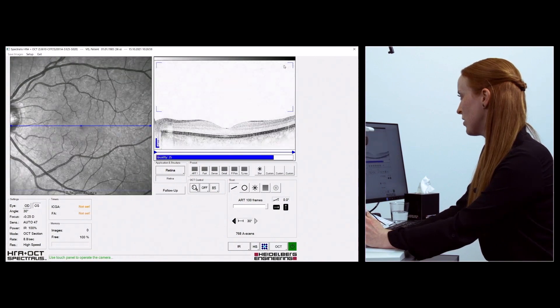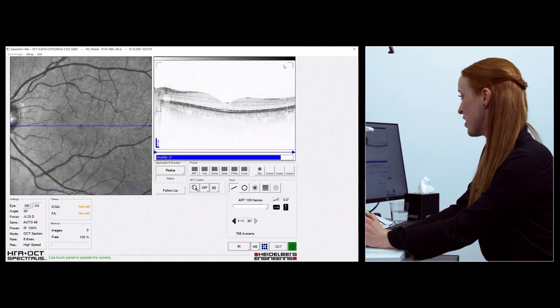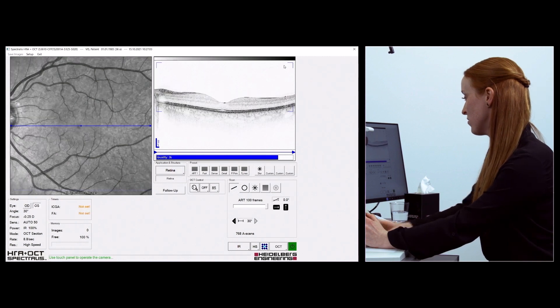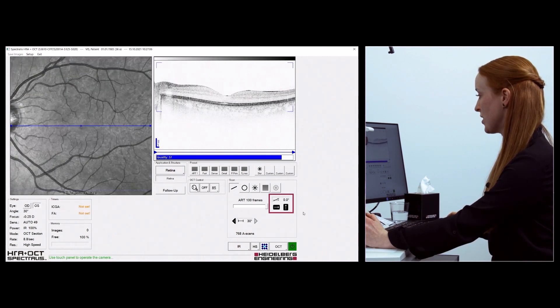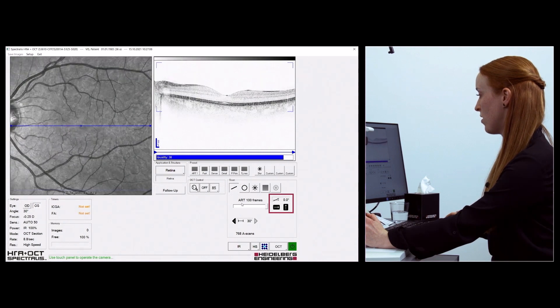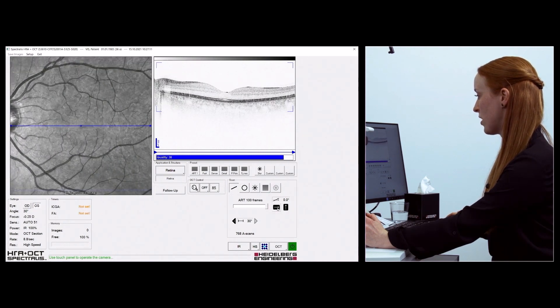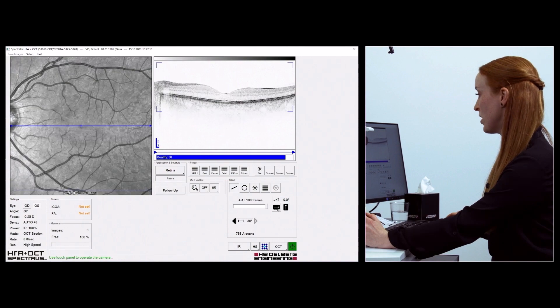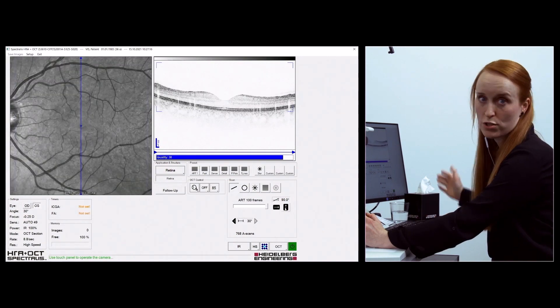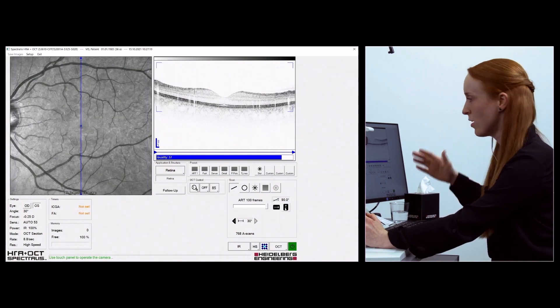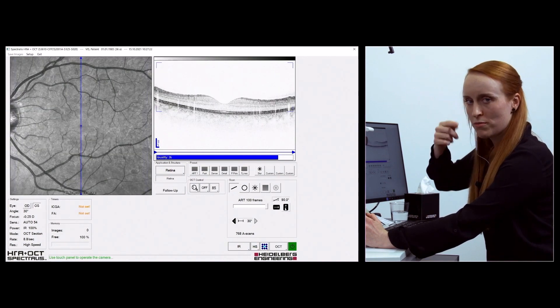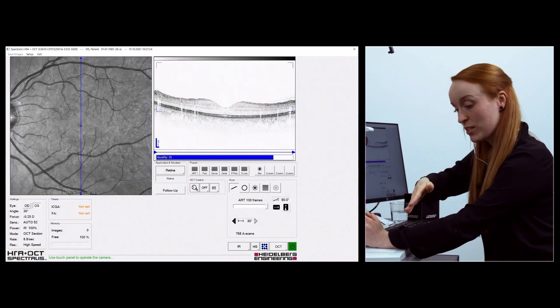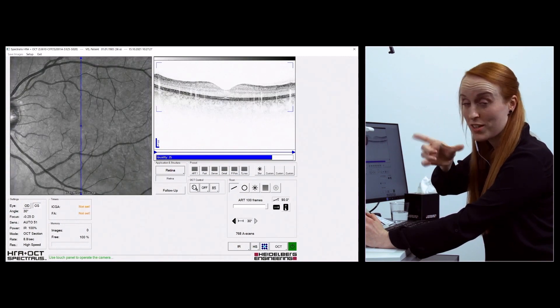Where do you have to look if you want to change the direction of your scan? First of all, have a look right here next to this area. There you have the direction of the scan - now it's set to 180 degrees and you can quickly change its direction up to 90 degrees. Remember, if it was tilted in one direction, in the worst case it just switches to the other direction.